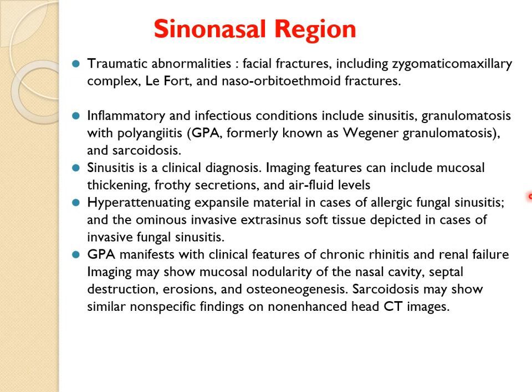We also have the sinonasal regions that must be evaluated if there are traumatic abnormalities such as facial fractures, Le Fort fractures, and naso-orbito-ethmoidal fractures. Inflammatory or infectious processes can also be included, like sinusitis, granulomatous polyangiitis, or sarcoidosis. Sinusitis is a clinical diagnosis, but imaging features can include mucosal thickening, frothy secretions, and air-fluid levels.